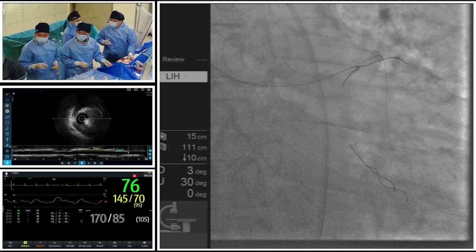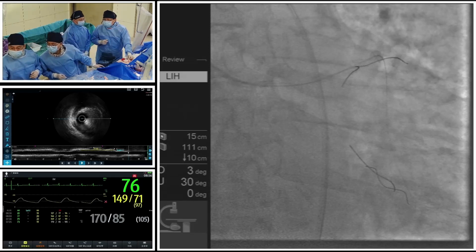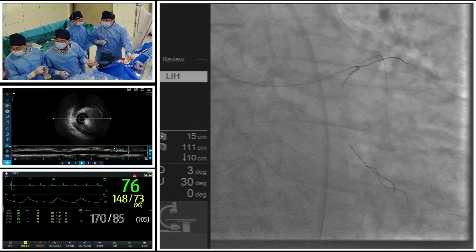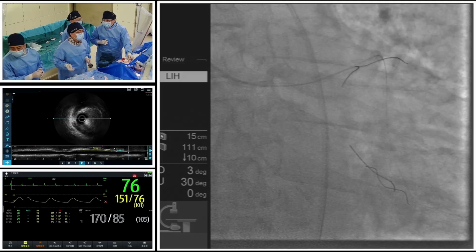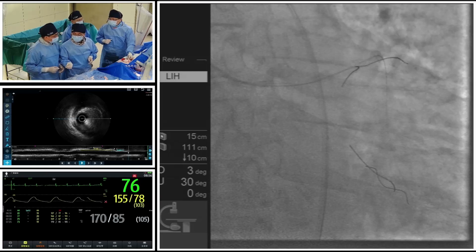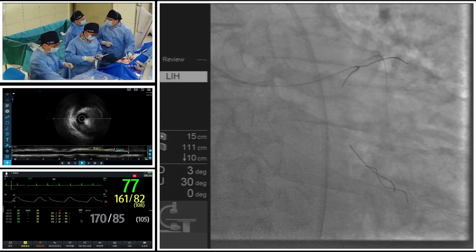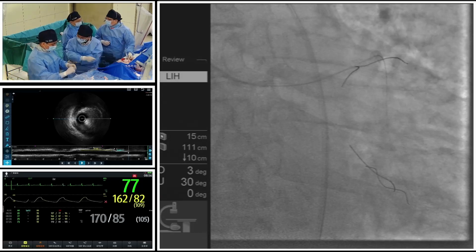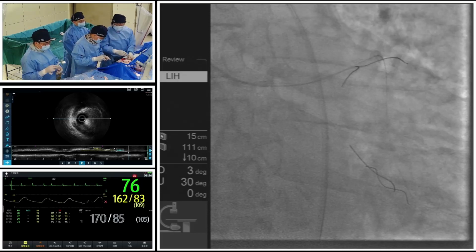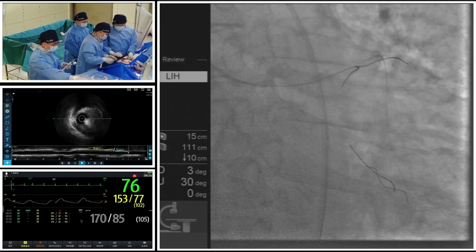Yeah, in most conditions, when we do a lithotripsy strategy, a 1.5 burr is large enough. Yes. But we must know the purpose of the rota. If we need to debulk more calcified lesions, we still need a larger burr to debulk the calcified lesion. So in that case, certainly we could also choose a larger burr to debulk the ostium calcified lesion. Yeah, but the intravascular imaging showed it was already good enough. Yes, not necessary.